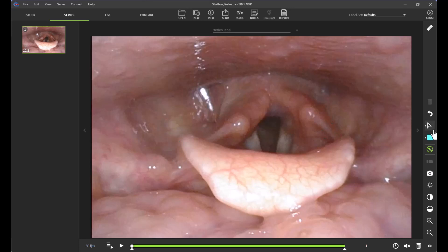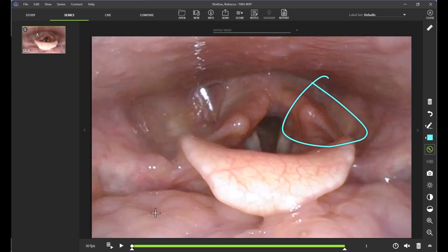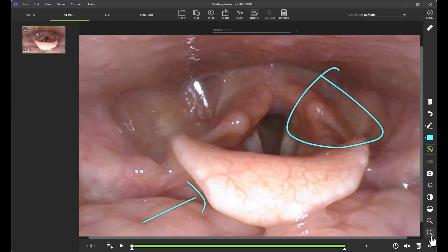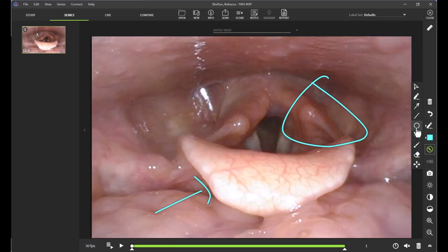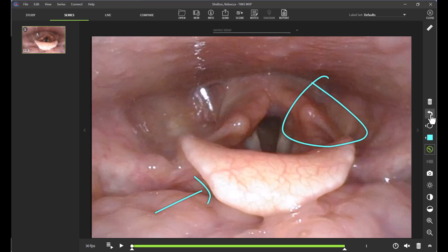To add in telestrations, I have several options. I can use my freehand tool to draw on my actual study. You can zoom in and zoom out with the magnifying glasses. I can also use my circle tool or my arrow. I'm going to undo what I just did by clicking the back arrow, or you can use the trash can bin.